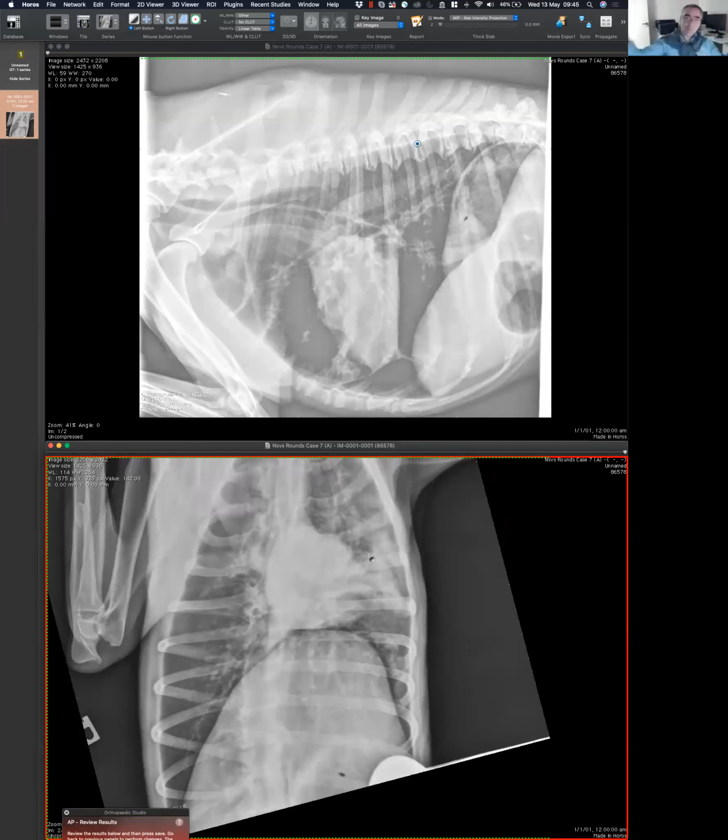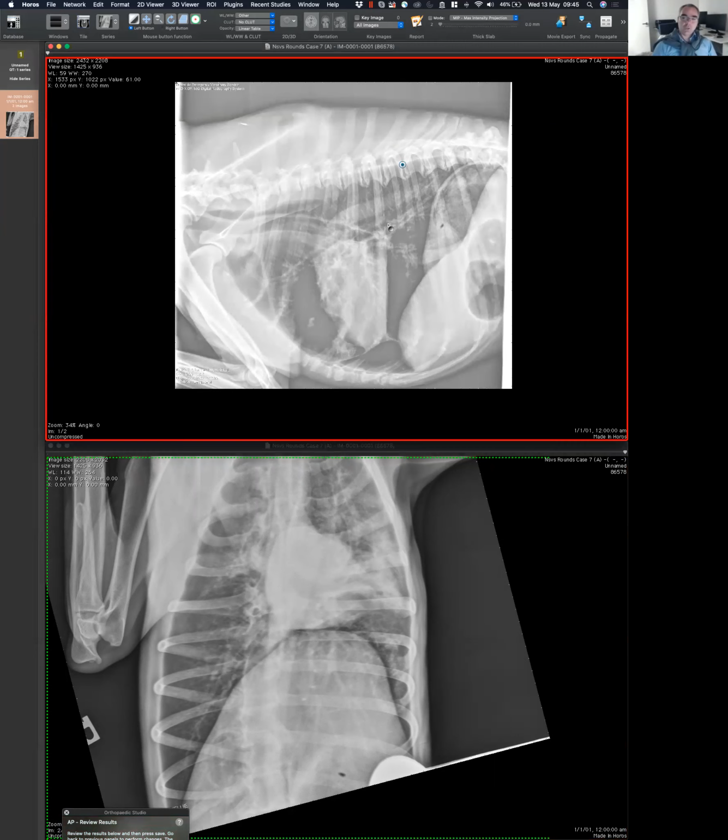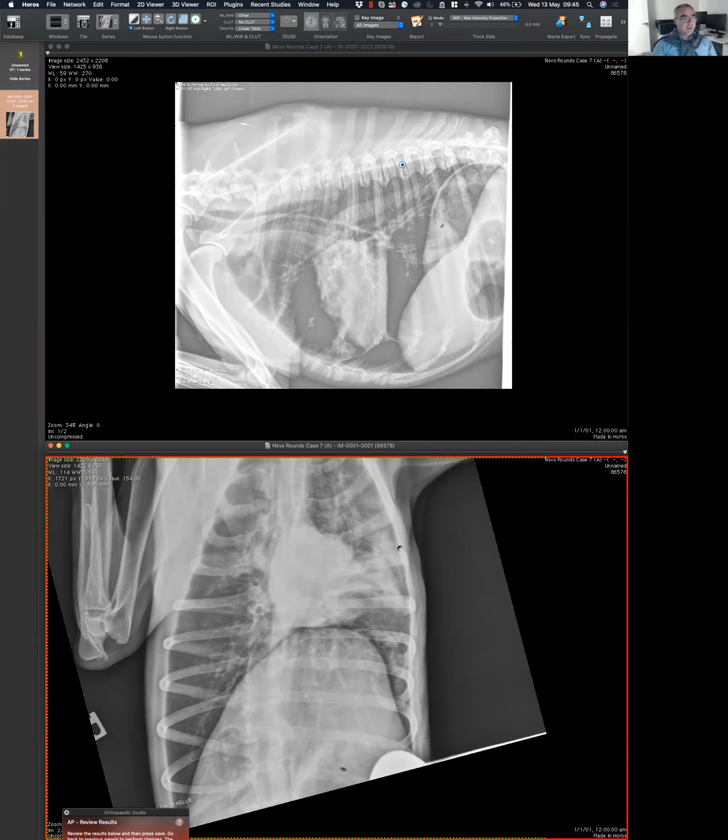Why am I spending all this time on that? There is a reason. Do you think having a left lateral versus a right lateral has any effect on your ability to see these lung changes? Yes. So how is that operating? Can any one of you tell me? And in the meantime you think, I'm going to bring a beautiful case. Anyone interested in explaining how this works?